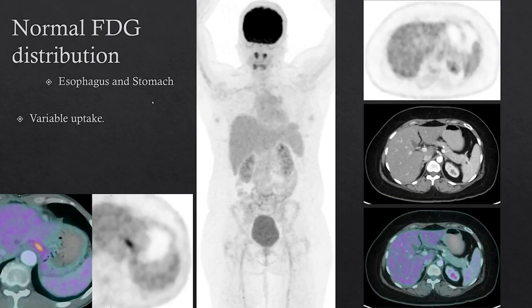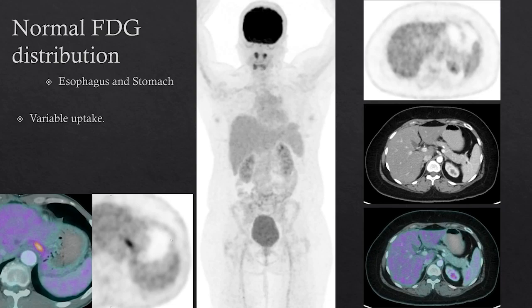Looking at distribution in the esophagus and stomach, you typically have variable uptake. If you see nice low-grade diffuse uptake in the walls of the stomach, this is normal. Sometimes if the stomach has collapsed, you can see increased uptake because all the activity is scrunched together. You can also see increased uptake with mild inflammation or physiologic uptake. Near the gastroesophageal junction, mild uptake is normal and could be mild inflammation or a normal variant.